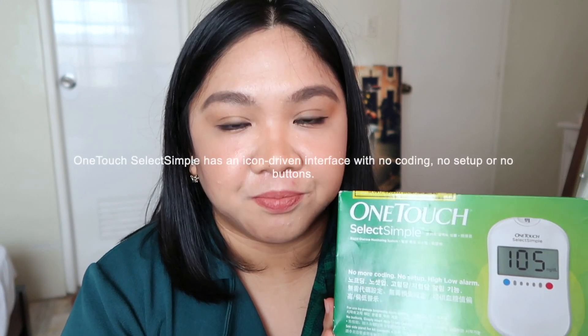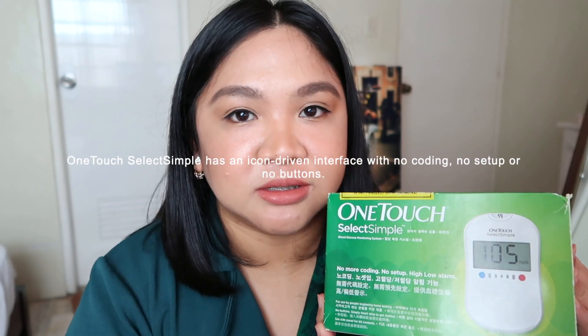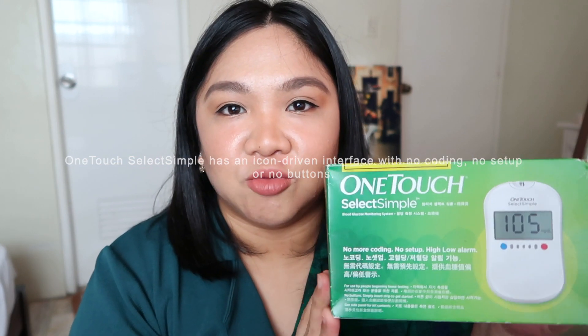This is used to measure your blood sugar either fasting or after meals. I'll show you the items of the box.